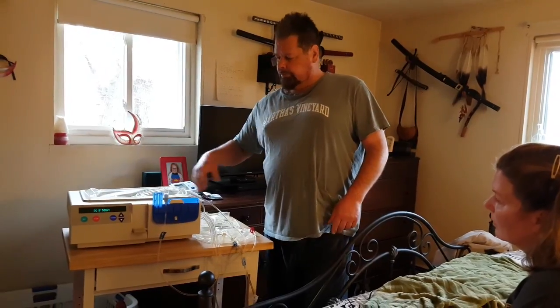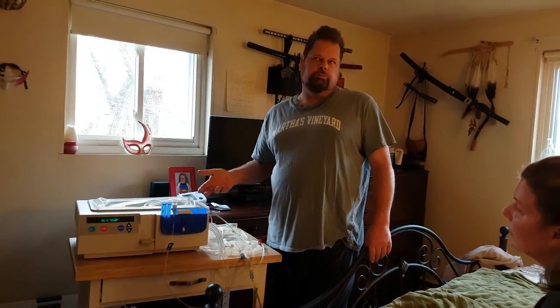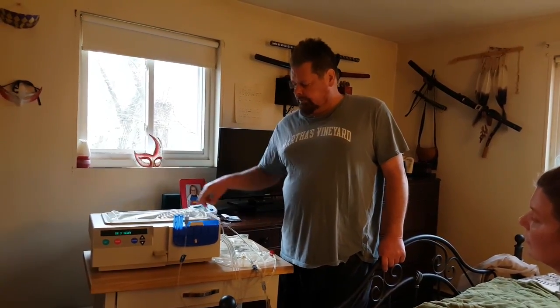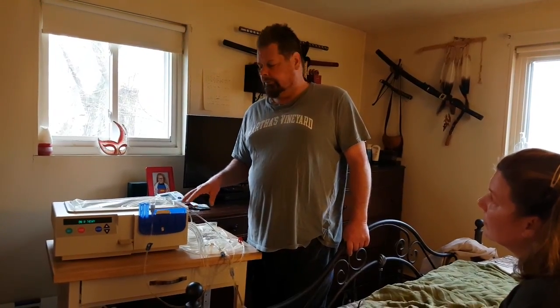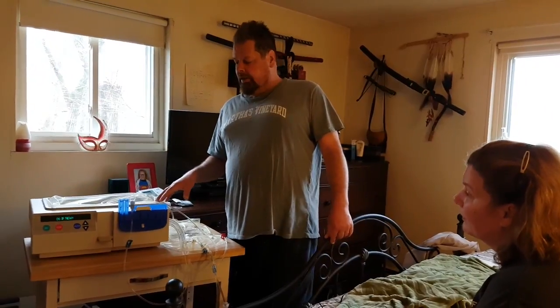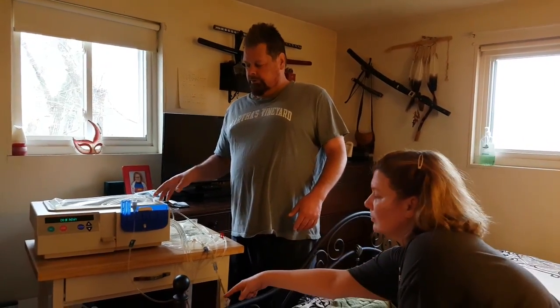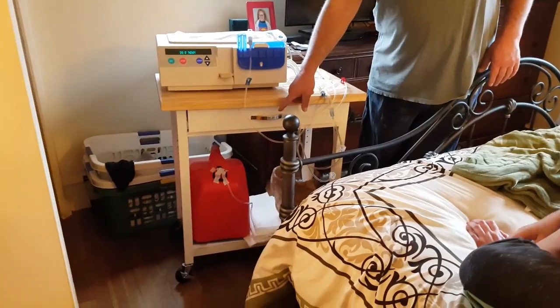And then it has to prime before you hook up. That takes a good 15 minutes to get the air out of the tubes, because you don't want any air in there, because that'll hurt. Anyway, once you're hooked up, you turn it on, and it does an initial drain because you have some fluid sitting in your belly all day, and that drains first into, we drain into a jug.